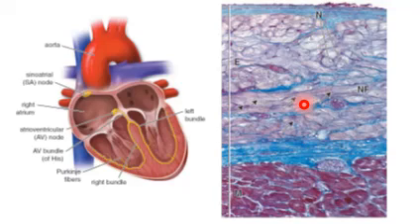I'm sorry for this. It contains a large amount of glycogen, and that's why it appears much lighter in comparison. The nuclei are surrounded by a much lighter cytoplasm, and this represents the extranuclear regions of the cells.